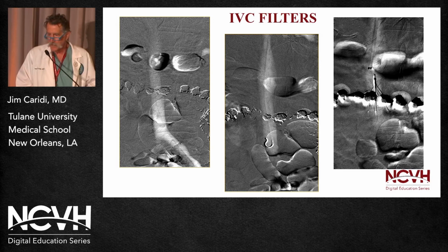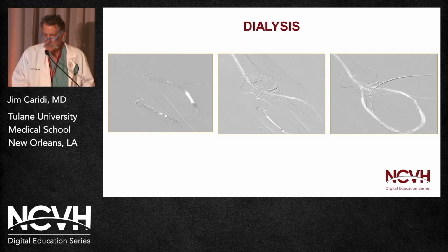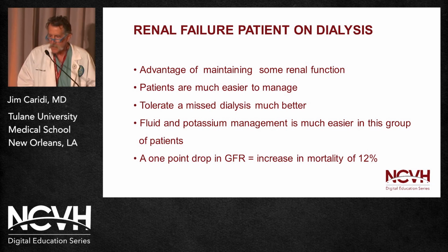This is for IVC filters. We can use it for dialysis. This is dialysis declot. There are some caveats with dialysis that you have to be aware of. And just remember, if the patient comes in and has some renal function, you don't want to destroy that function because if you decrease their GFR, you increase their mortality.